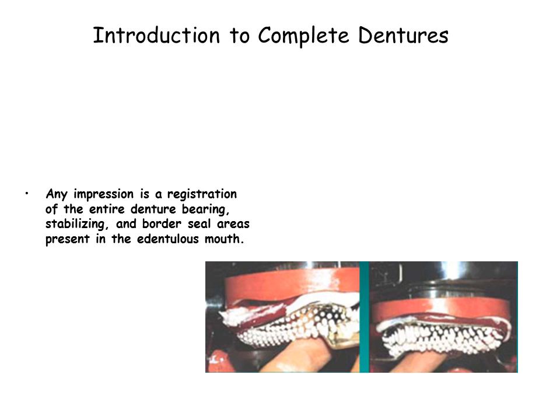The objectives of an impression are to register the tissue in such a manner that the prosthesis developed will provide support, stability, and retention. It should record the potential denture-bearing surfaces and the peripheral limiting tissues which enhance retention. By maximally extending the denture to cover areas of support, stress on any one area is reduced. A snowshoe is a common analogy.